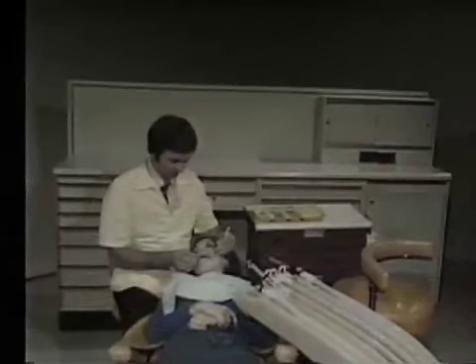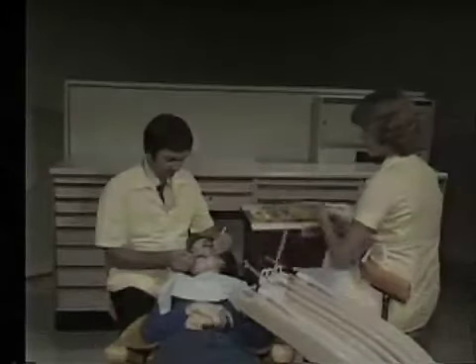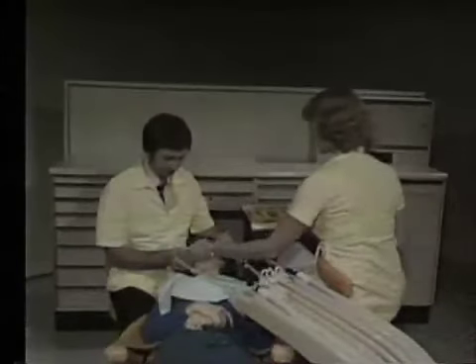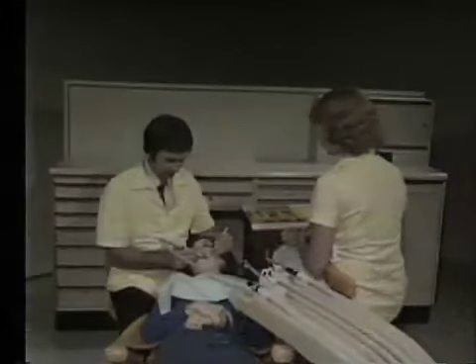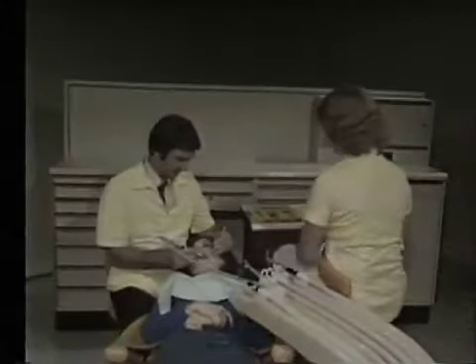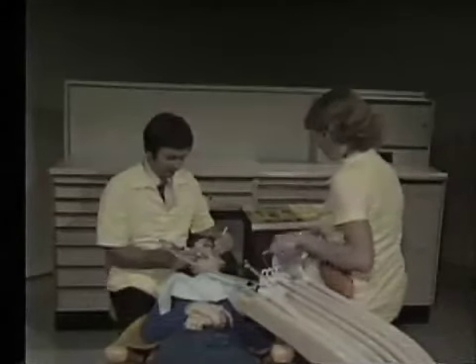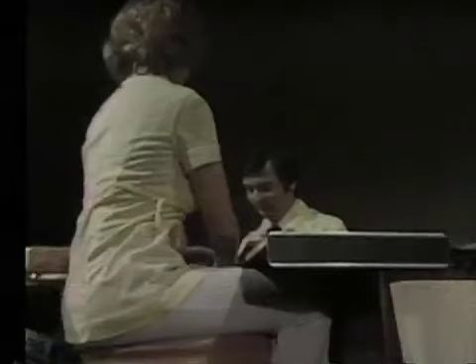The dental assistant's chair should be stable, well cushioned, and equipped with an adjustable abdominal support and footrest. Generally, 5 casters and a broad base provide the necessary stability. Height adjustment should be easily accessible. Adjusting the chair 4 to 6 inches higher than the operator provides better access to the oral cavity. The assistant's back should be upright with the stool adjusted to offer support just under the rib cage. The legs are positioned parallel with the upper portion of the patient's chair.